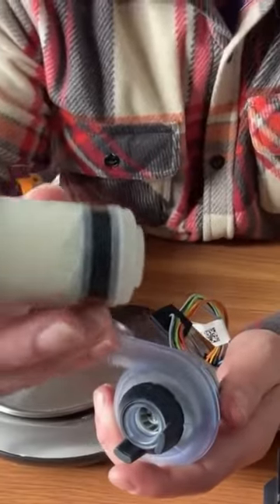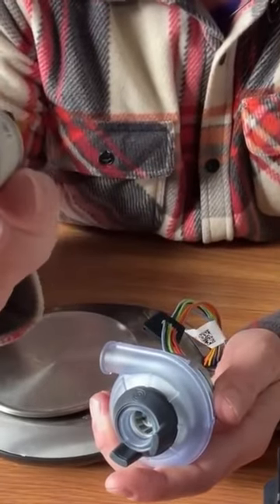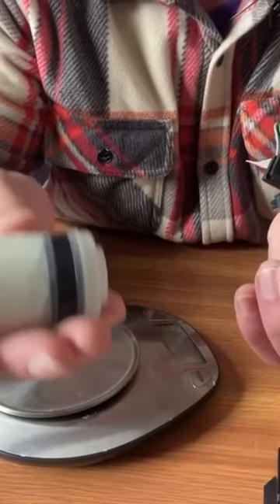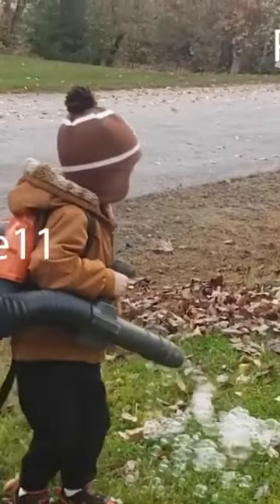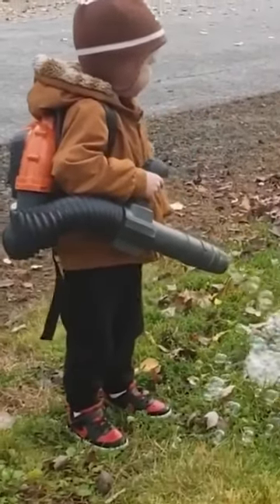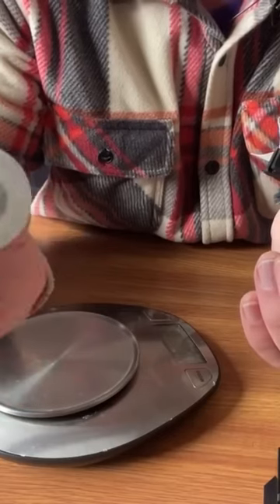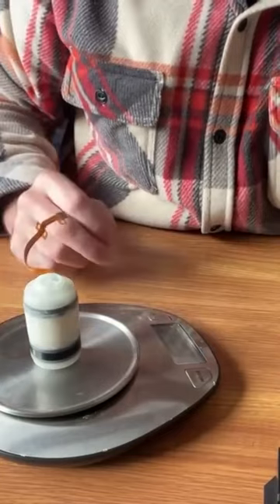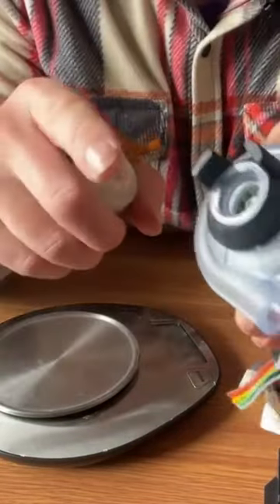Here's the AirSense 11 blower — they use the same blower in the Air Mini as well. And compared to this, it just feels like a toy. It's all plastic, it just feels cheap, and it weighs 84 grams. Now I can buy these.